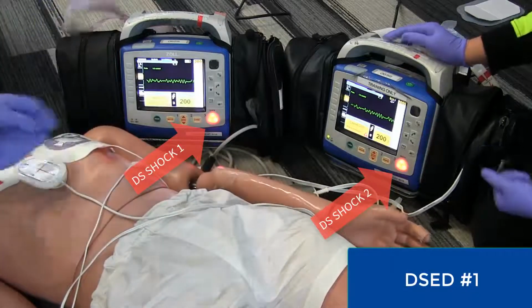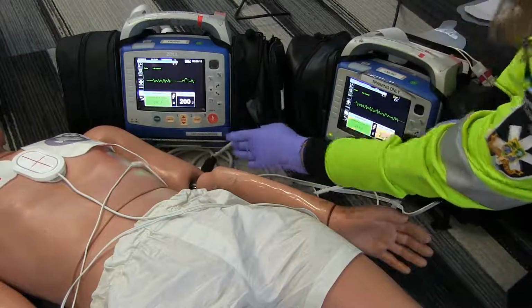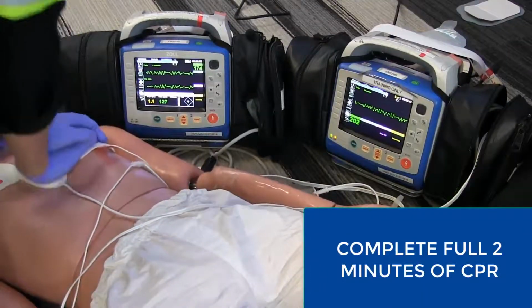Stop CPR. I'm clear, you're clear, everybody's clear. Shock one, shock two. Continue CPR. Complete the full 2-minute CPR cycle.